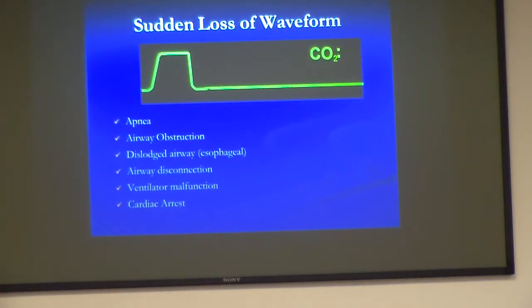And I go, check it again. He goes, Gloria, it's still 0. I go, is it dash, dash, dash? Because dash, dash, dash is usually like we have a malfunction of the end-tidal CO2. He goes, no, it's this flat line and it's 0. I'm like, well, okay. So we took him off. This is not good. We're not going anywhere.